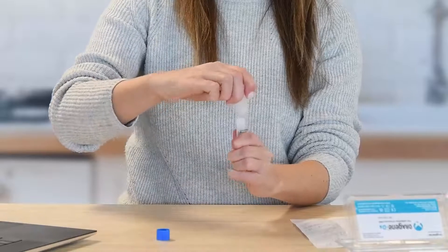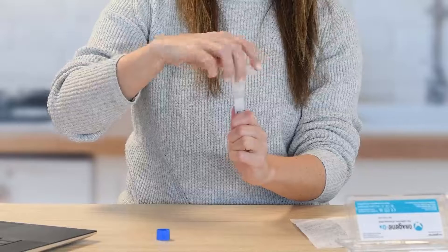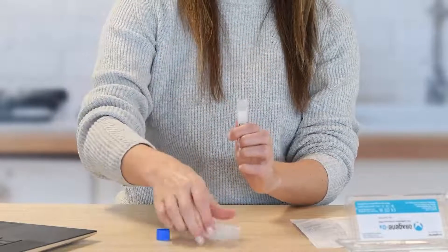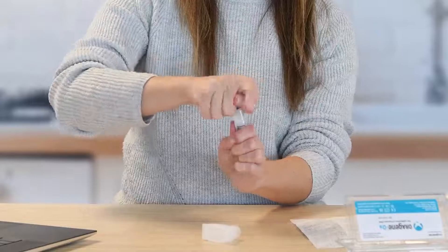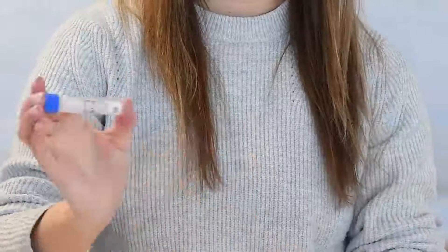Hold the tube upright and unscrew the tube from the funnel. While keeping the tube completely upright, pick up the small cap and use it to close the tube containing your sample. Shake the cap too for 5 seconds.